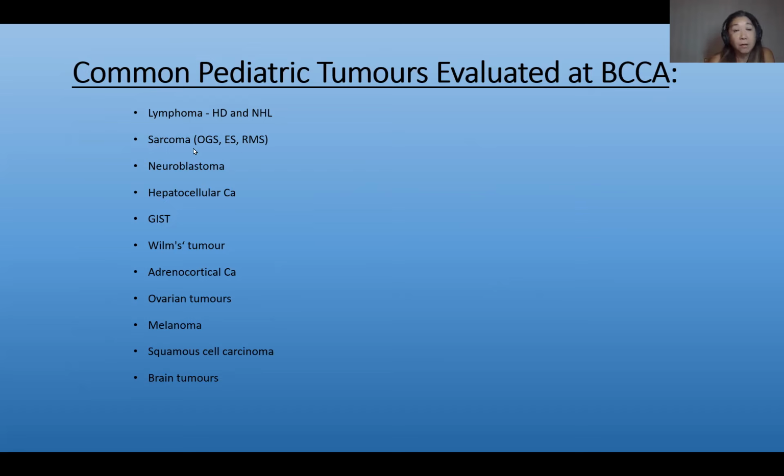We still do bone scans on them, but we used to use thallium to evaluate treatment response, and now we can use PET. Neuroblastomas, we traditionally use MIBG, but sometimes MIBG is equivocal or even negative, in which case PET may be useful. Those are probably the more common applications in pediatrics.